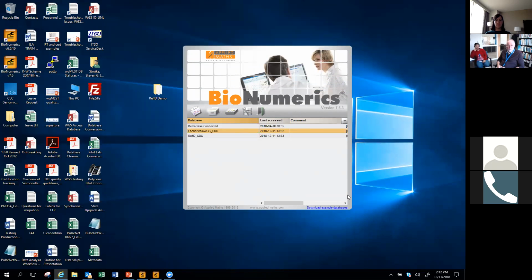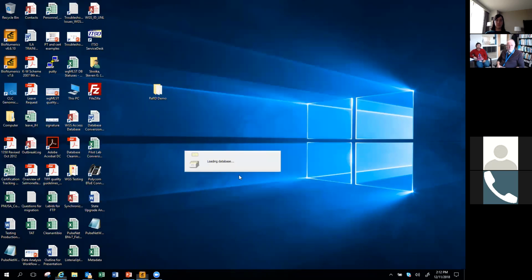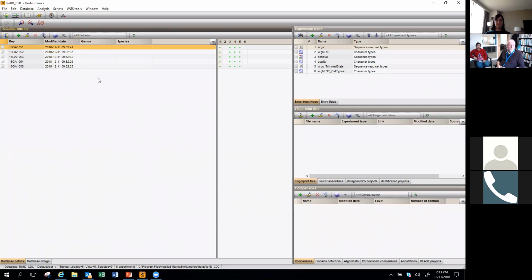So you'll have your BioNumerics databases here. You'll have your databases created. I have, for demonstration purposes, an Escherichia database, as well as a Reference ID database. So I'm just going to open my Reference ID database by double-clicking on it. And the database opens, and I can see some entries here already.